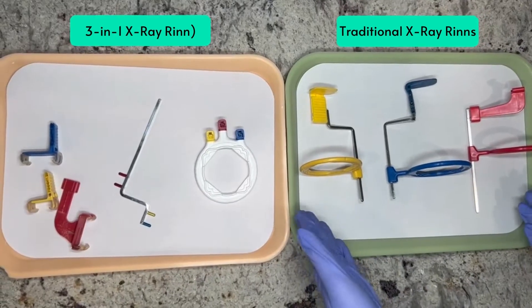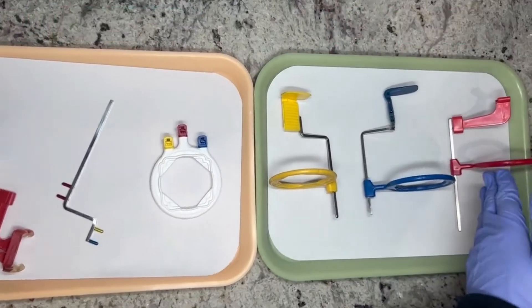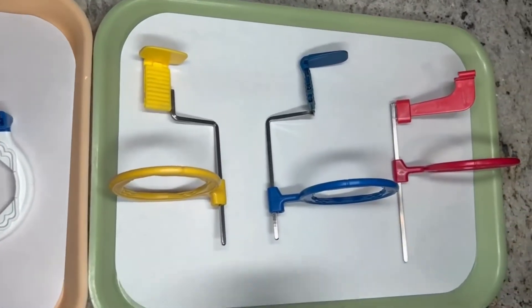So these are your traditional X-ray rings where the colors are all separate and they use three different ones to take your X-rays.